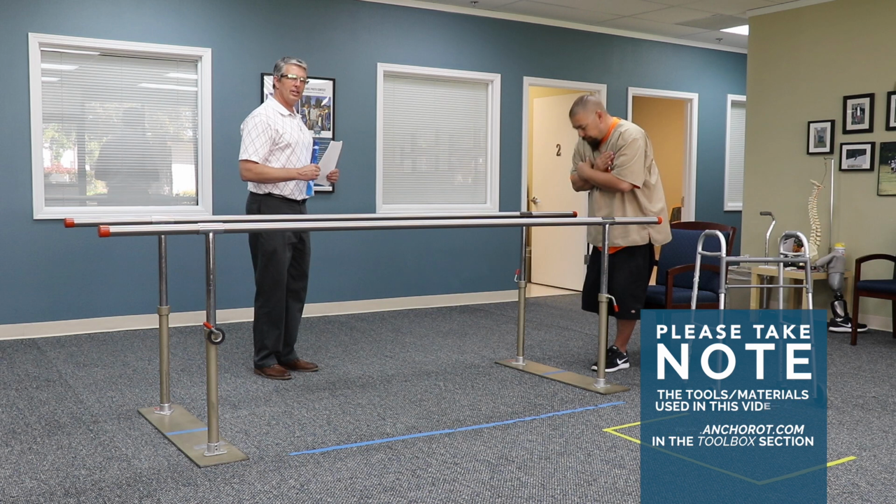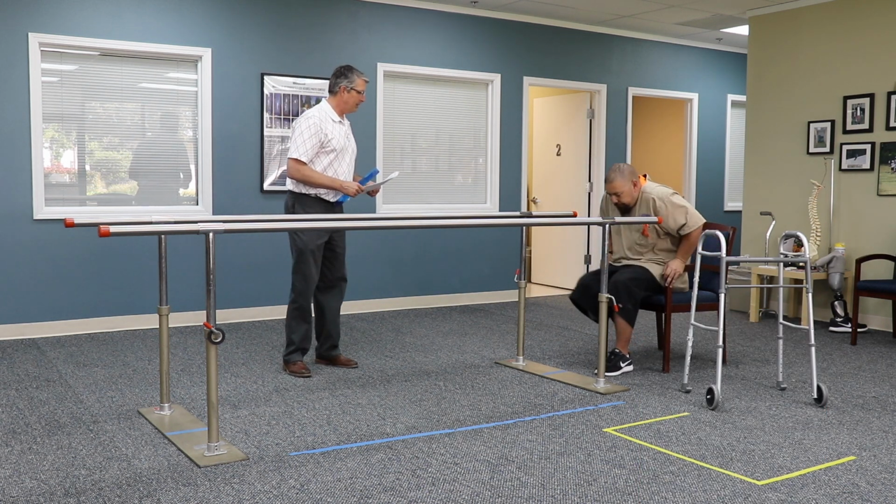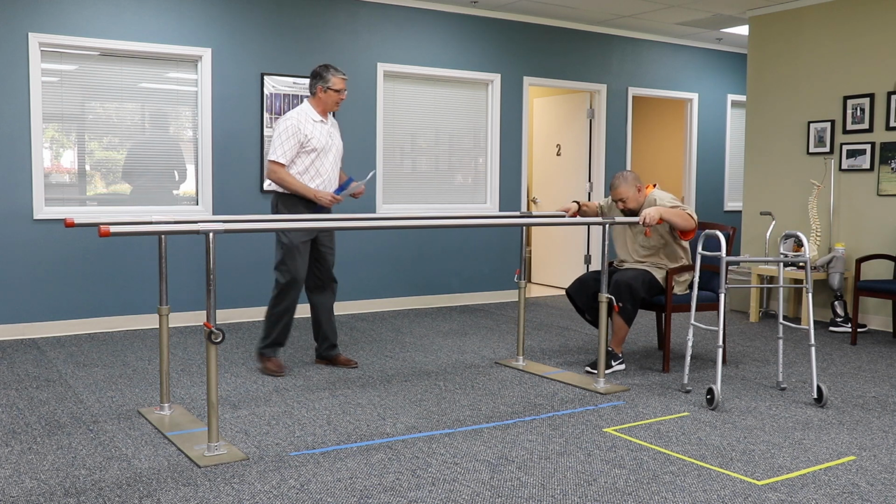Okay, go now. We're going to do this again, show a different way of doing it. Use the parallel bars. Okay, go ahead and stand up.